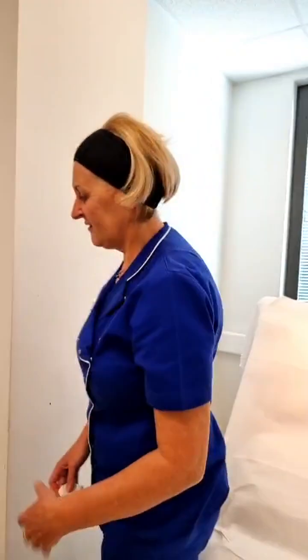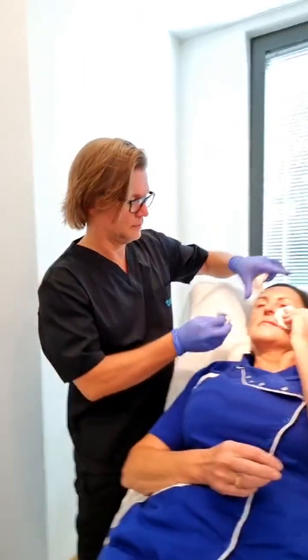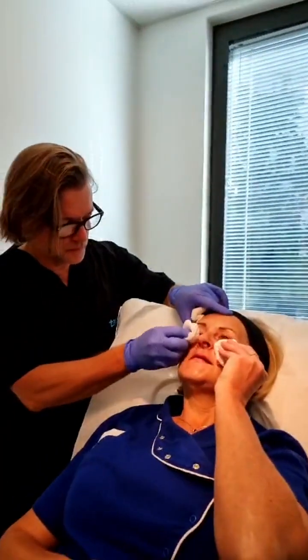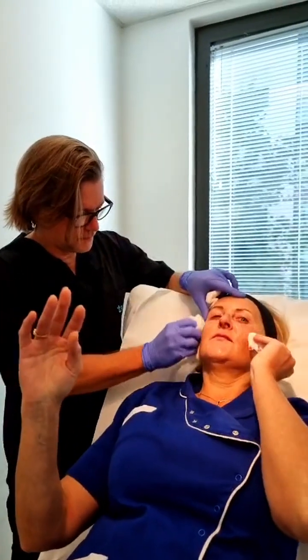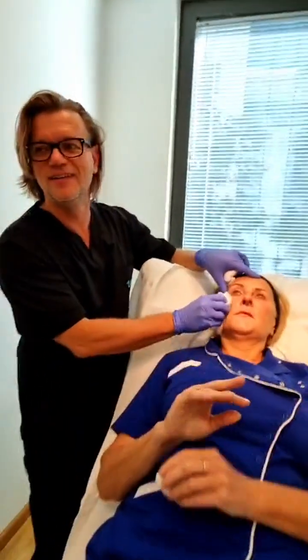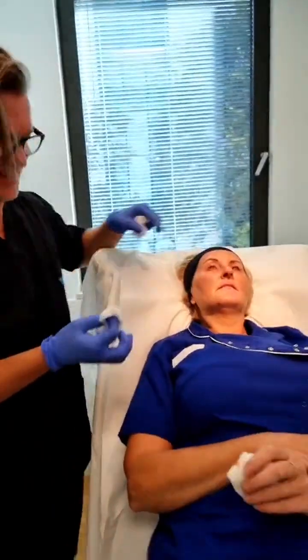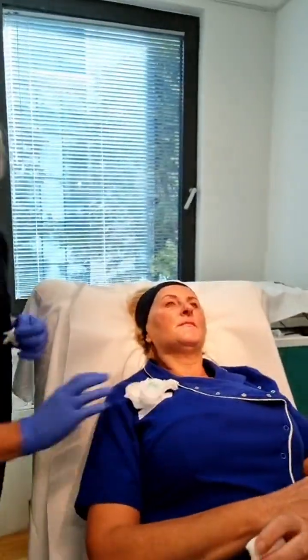I'm not photogenic. It's rough. Your hand, you have such a light hand. Because I don't feel anything. Good, good. Without numbing cream, anesthesia helps a lot. Well, without anesthesia, it's the same. I can manage. It's okay.